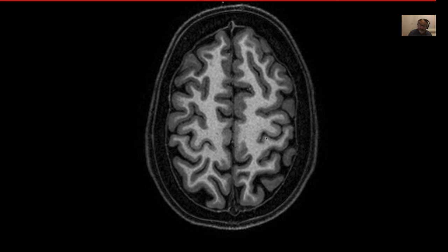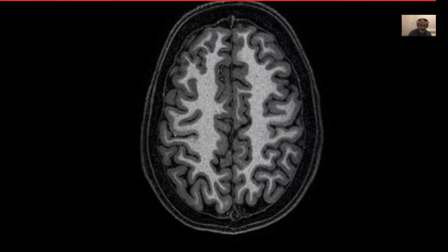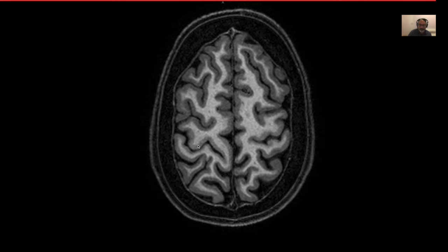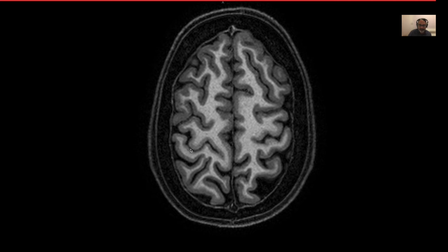Yes, it is actually quite posterior. Usually, sometimes it's a bit more anterior over there, but it's actually quite posterior, especially high up, right up at the top of the brain. And as you move inferiorly, it will go more and more medial. But it is quite high up. And so the inverse omega sign, that is your central sulcus on this side, and that's the central sulcus on that side. And so that's the frontal lobe, and this is the parietal lobe. That's how you first start with this.